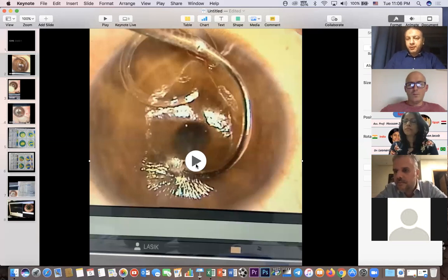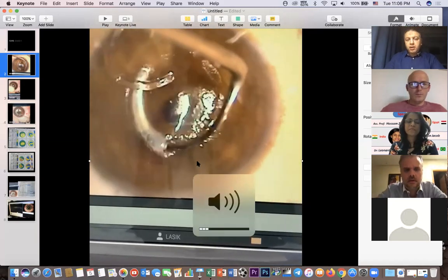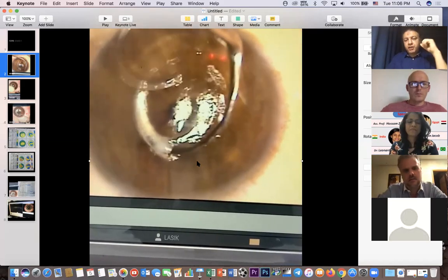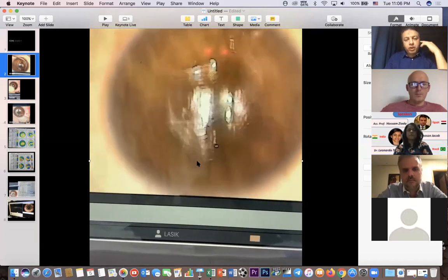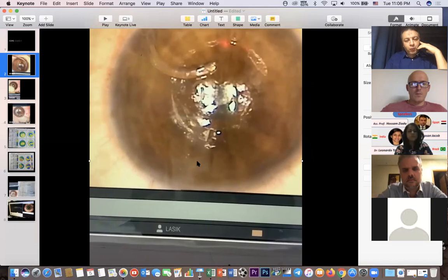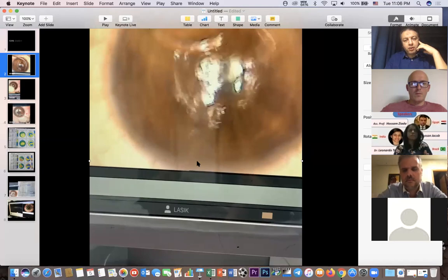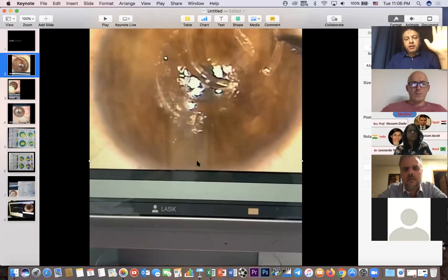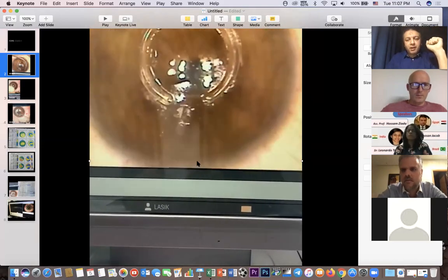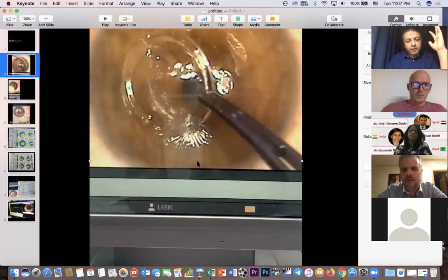Can you see my screen? Yes. Are you seeing this video? Yes. Okay. This is a primary case with no history of cross-linking. But while I was putting the 320 arc length intracorneal ring, I found it very, very difficult to introduce or enter this segment.